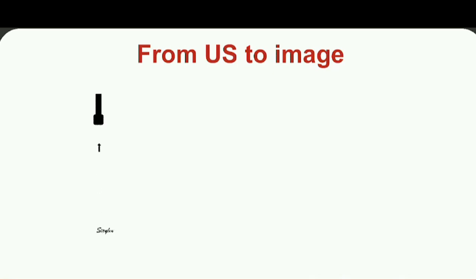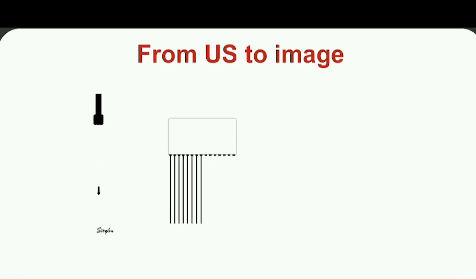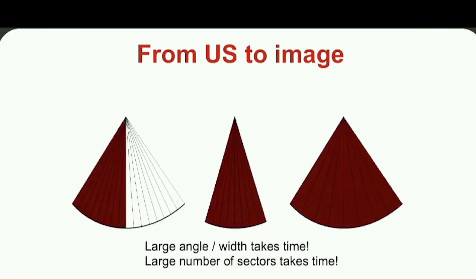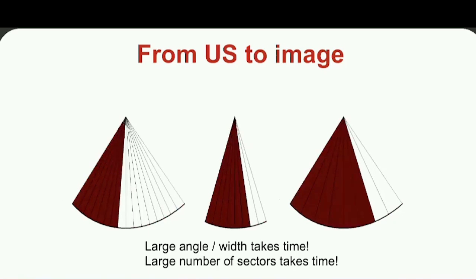Now, imagine the transducer as having a number of crystals side by side, and each of those crystals is producing an ultrasound beam. You successively form these sound waves as you go through all the crystals in the transducer, and the process starts all over again. Once the entire process is completed, from the first line to the last line, a number of lines are created, and it forms one image. This is called one frame.